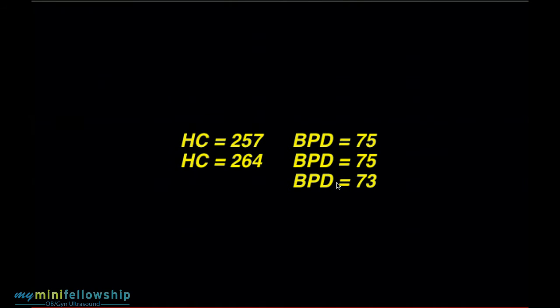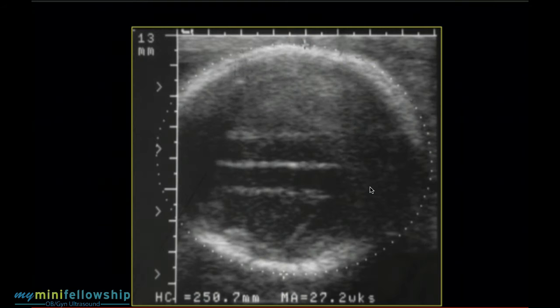So again, we know that it's an error, but you can appreciate that the direction and the magnitude of the error would typically not indicate that it should be remeasured. Now again, we want to do the measurements perfectly, but if you're planning that every measurement you ever look at is going to be perfect, you're in for a lot of disappointment. What I'm telling you is that you have to have a handle on the magnitude and the direction of the error. Then rational judgments can be made.